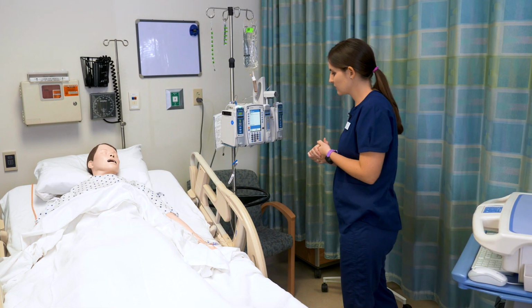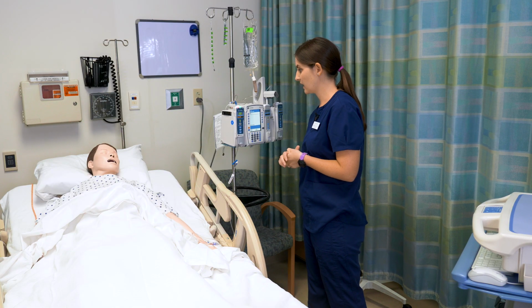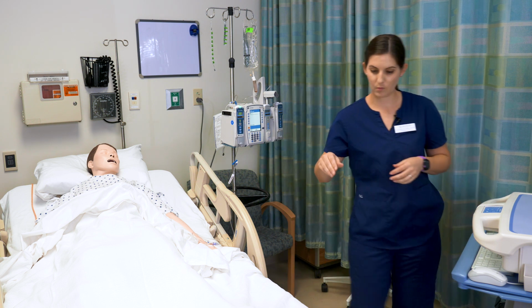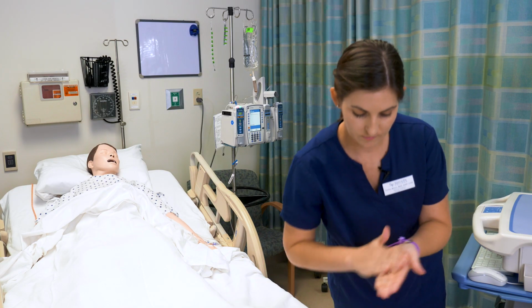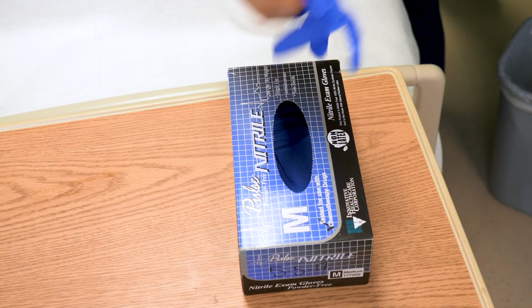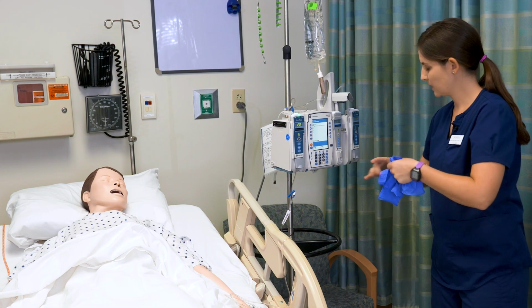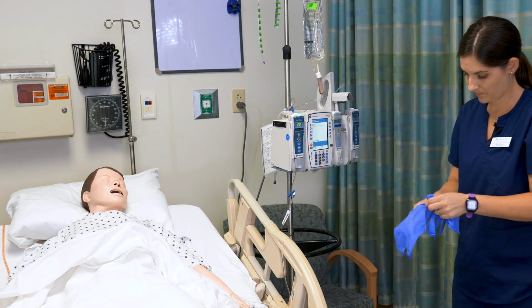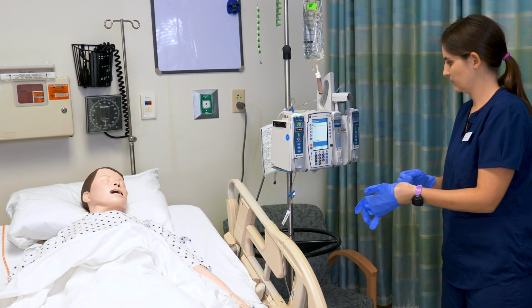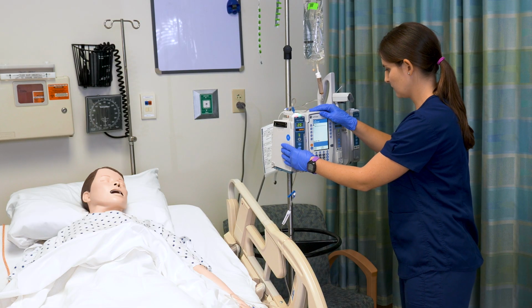Okay, Ms. Duncan, I see that your IV is complete and the doctor has ordered to disconnect the IV fluids. So I'm going to go ahead and take care of your line. So let me wash my hands. Put on gloves. I'm going to go ahead and just silence this so it doesn't keep beeping on us. Okay, so I'm just going to turn off my pump here because I do not need it anymore.